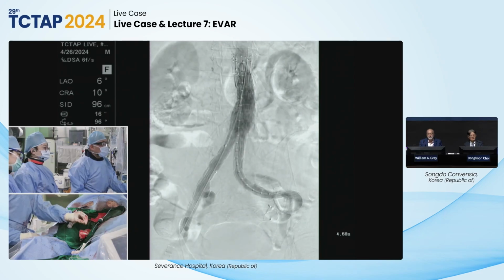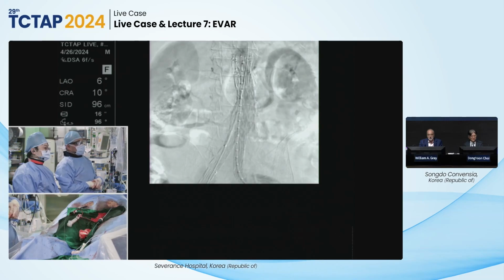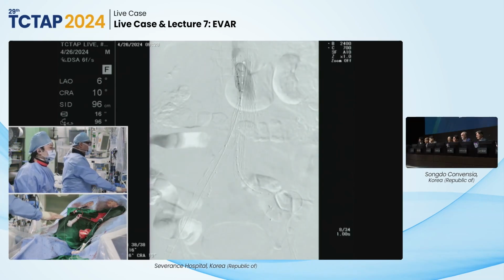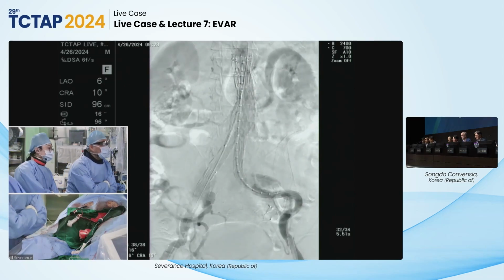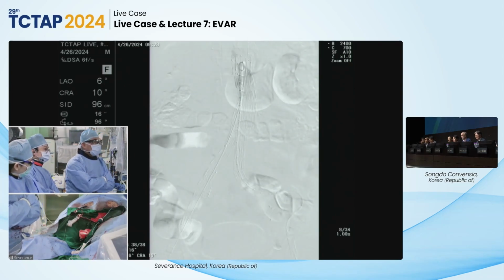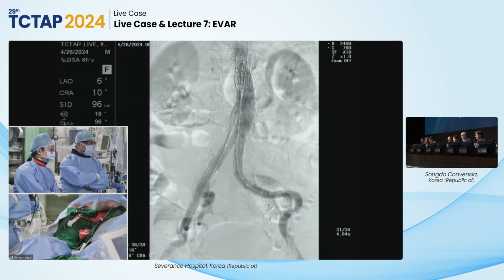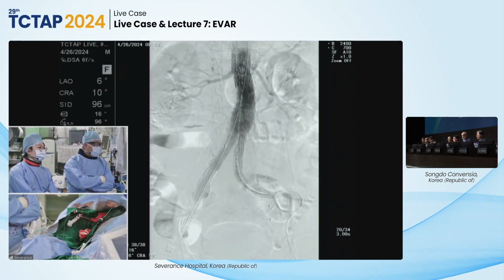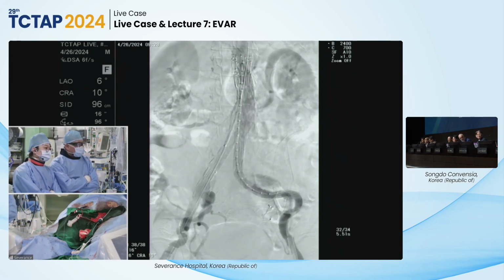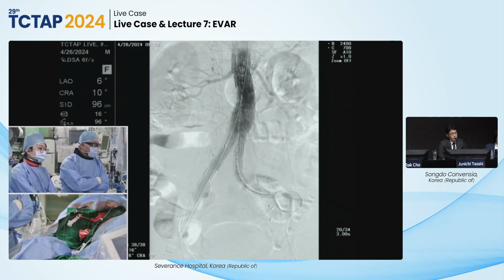Excellent. So, do you have any comment? Excellent result. Yeah, so I think I'm happy with that result. Very good. This patient has a very tortuous external iliac artery. Do you plan to implant a bare nitinol stent?